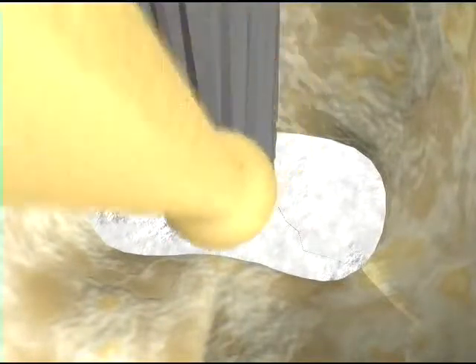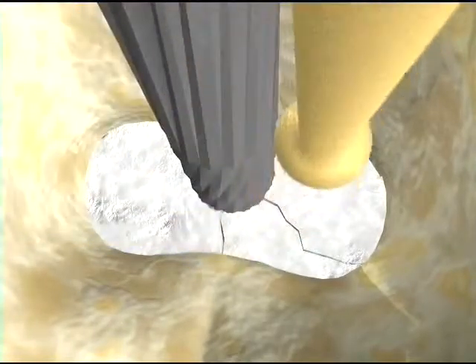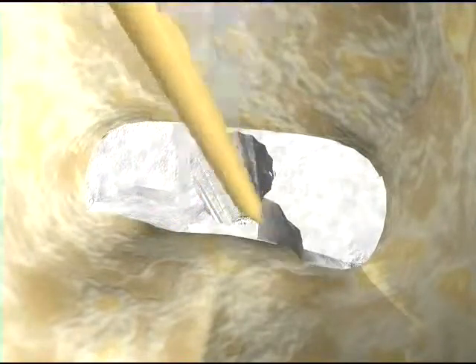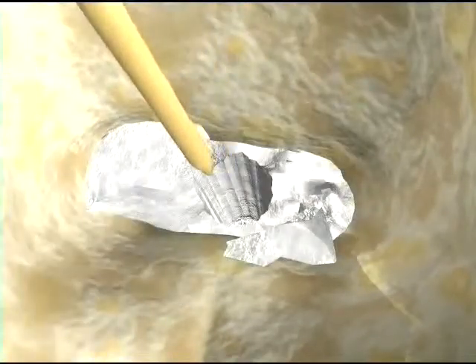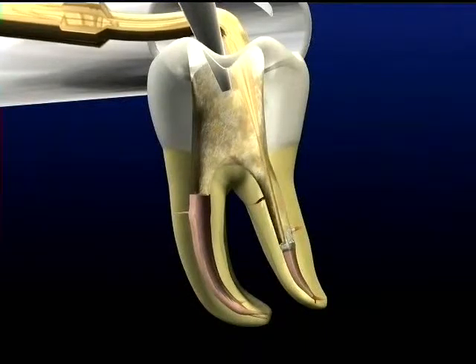ProUltra Endo Tip No. 1 is meant for difficult jobs and can be used up to power setting 13 or 14. With the post removed, smaller instruments are used to break up the remaining cement. The smaller instruments must be utilized at much lower power settings. The typical maximum is 4 for ProUltra Endo Tips 5 through 8.